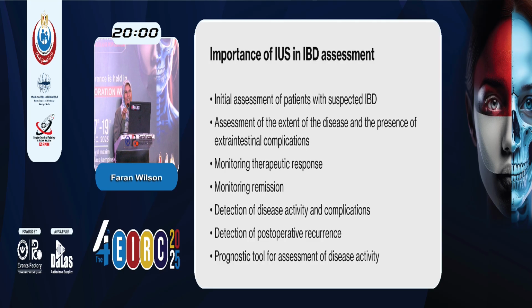Well, my lecture is called IUS, a Rising Star in IBD Workup. And this is because early this decade, the main parameters for diagnosing IBD were endoscopy, CT, and MRI. And IUS did not feature in the guidelines at all. But due to lots and lots of research, IUS has become an important part in the IBD assessment.